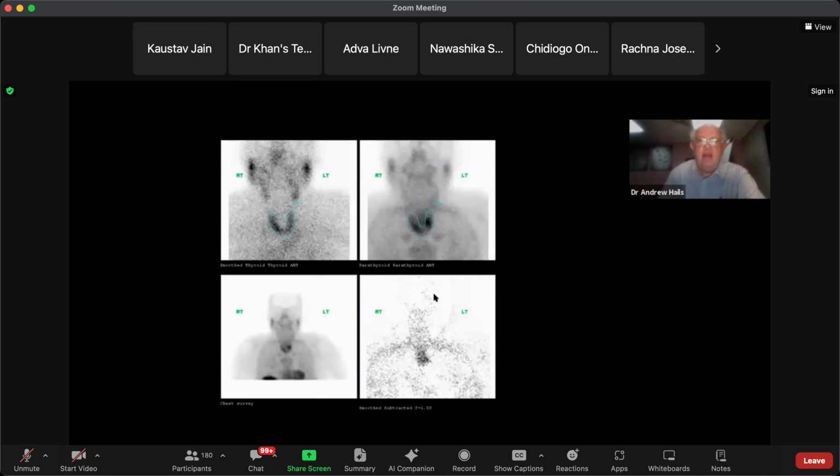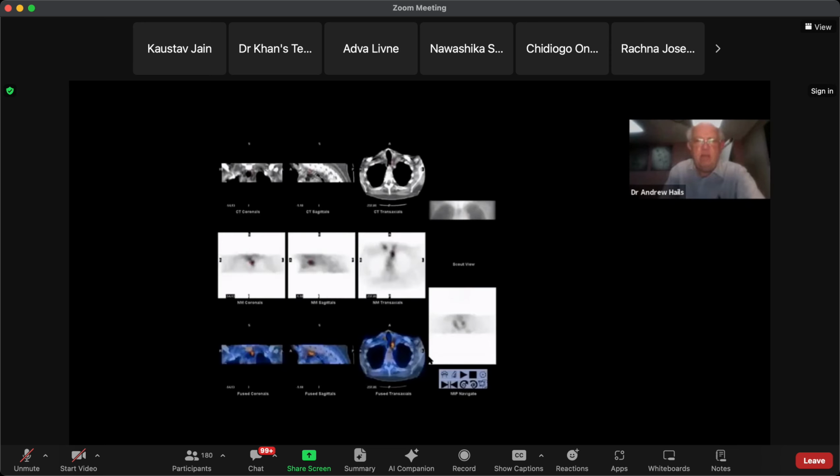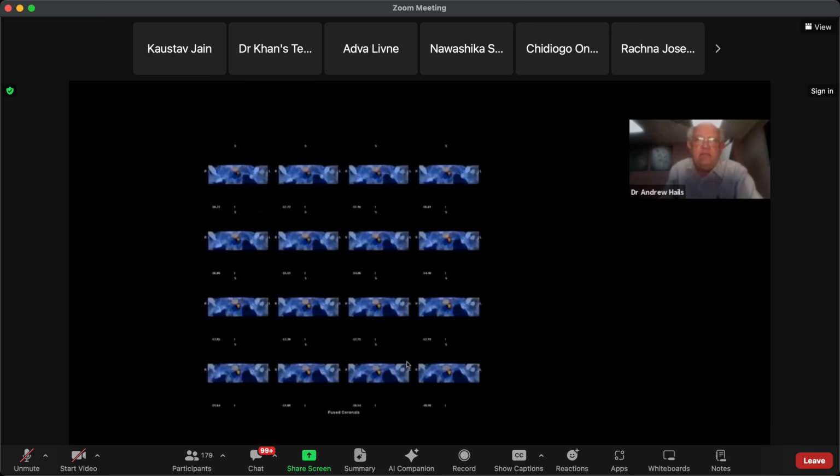That's again another thyroid, Pertechnetate, SESTAMIBI. Take one away from the other, and you get the site of the parathyroid adenoma. And we have here got it on the SPECT CT images where the parathyroid adenoma is. And the idea of this is it makes it easier for the surgeons. At least in theory, they then don't have to explore both sides of the neck, and they can hone in much better for where the parathyroid gland is.